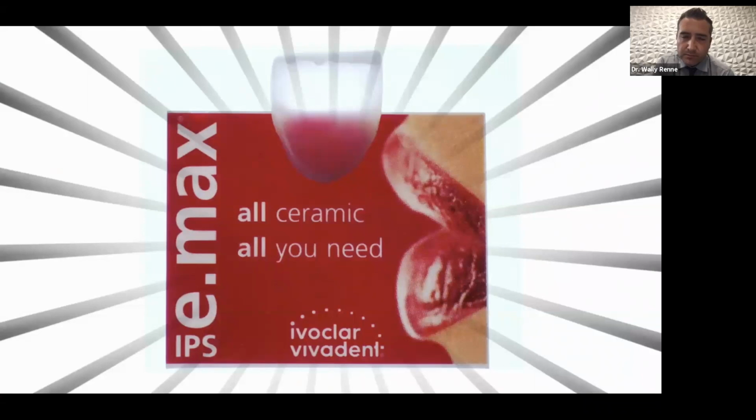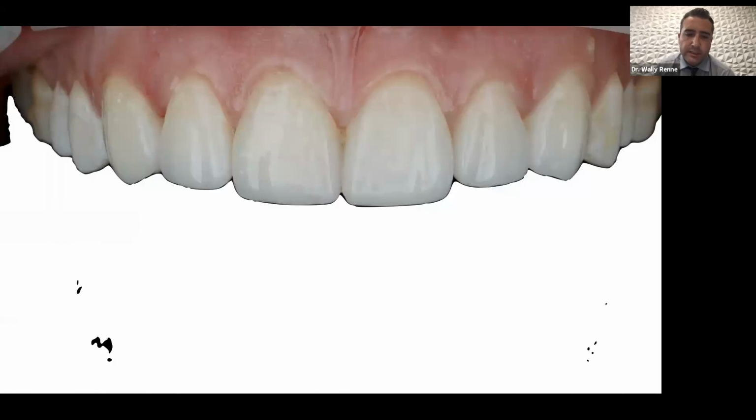So it's really cool. And so after all that, this is what they look like on delivery here. Sorry for the black outline there, something is going on with my computer. But yeah, really cool stuff to be able to do.